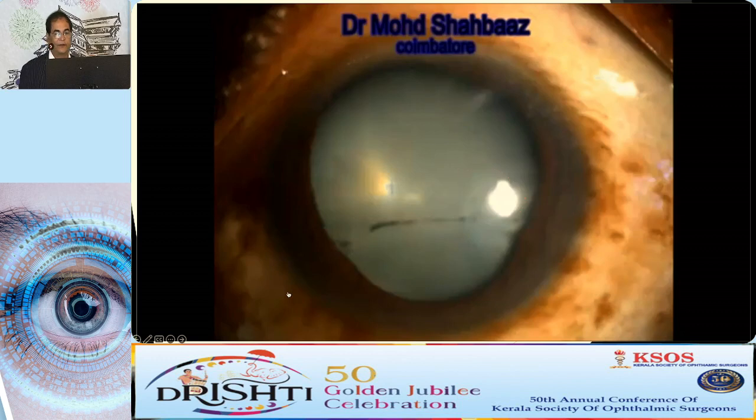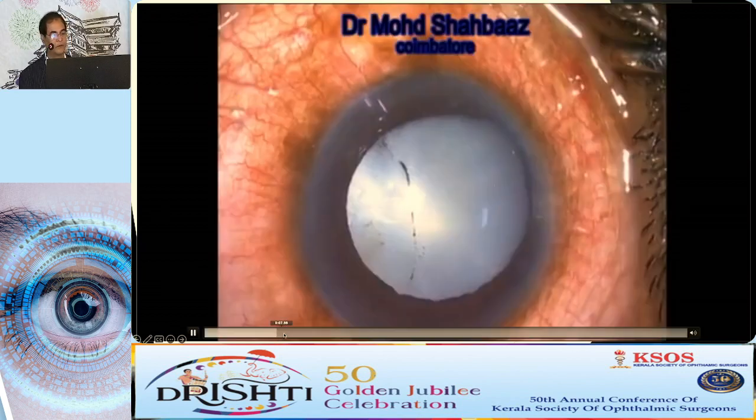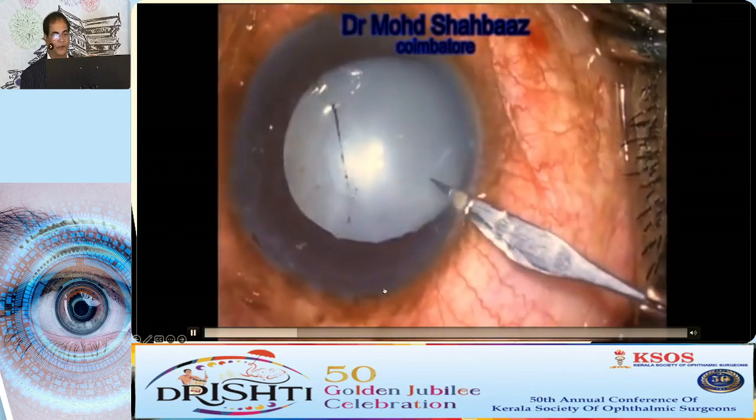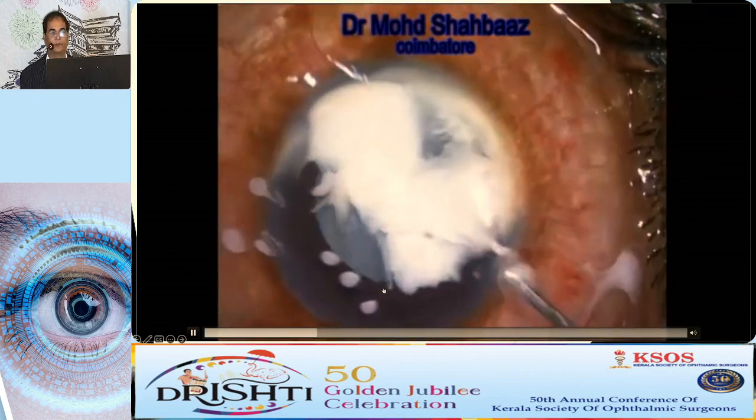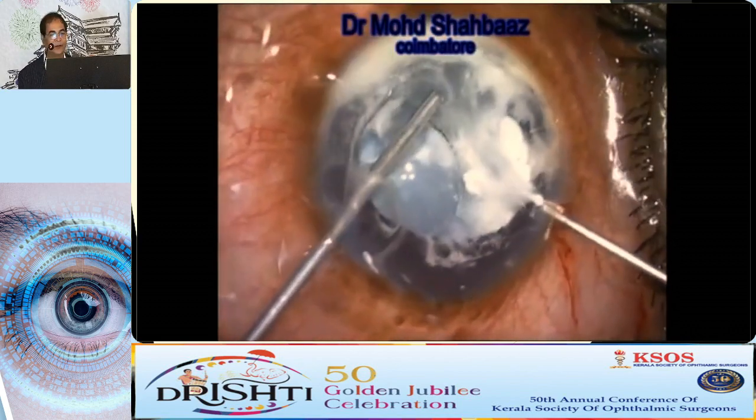Another case is like this, where it is very difficult to recognize which side the vitreous is. Anybody can guess? The larger side, this side, is vitreous, because the zonular dialysis is on this side. Again, in this I used triamcinolone first, because I was also very confused, as that line was making a demarcation line.